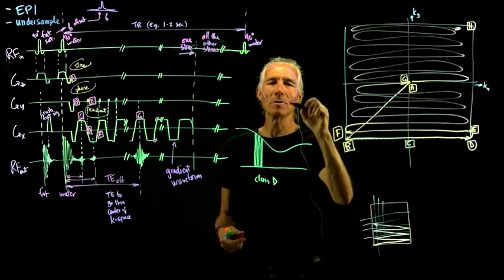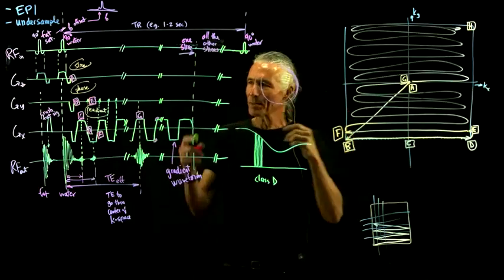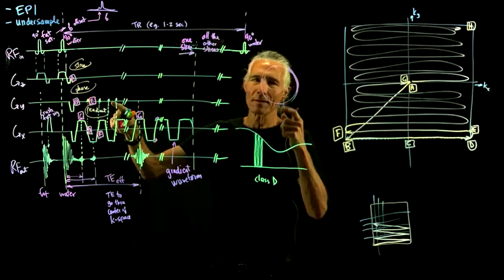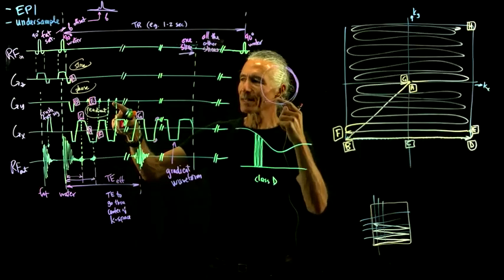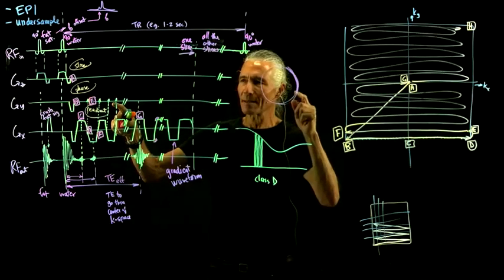And for a normal pulse sequence that is not, so one of the problems here is that these little blip gradients are really small. And so any B0 problem, like for instance due to the fat, because the fat is resonating at a different frequency, has more chance to mess things up because the ratio between the magnetic field offset and this little gradient is unfavorable.